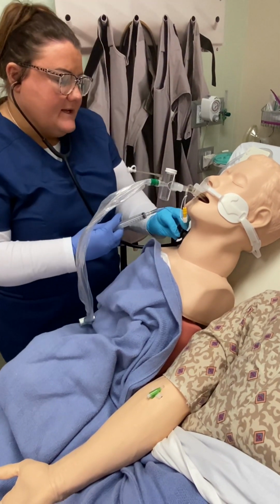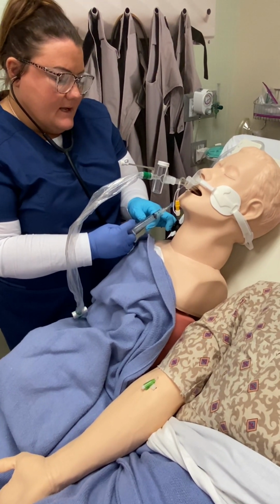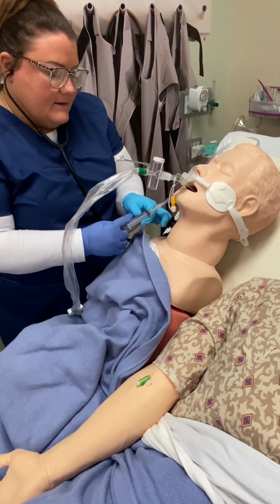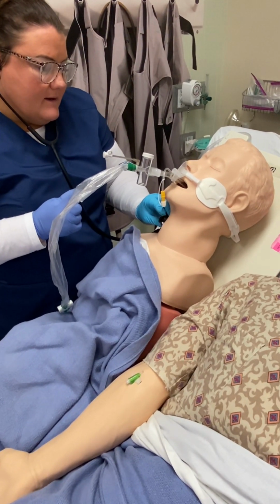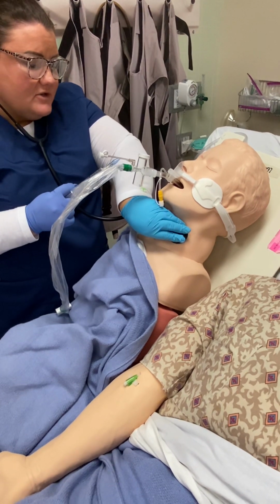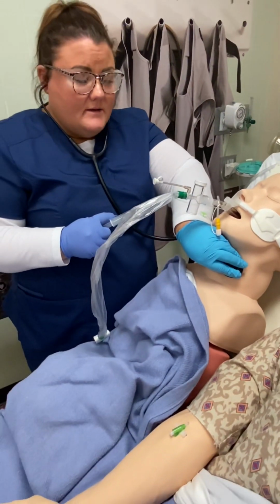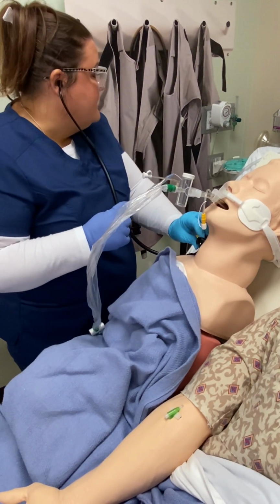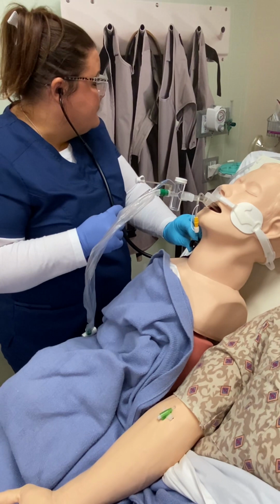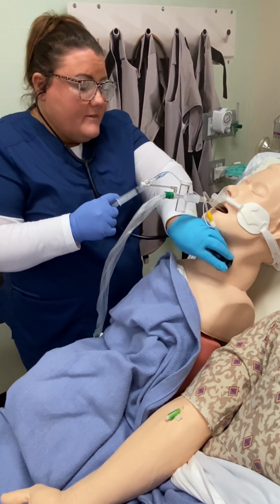Okay, Mr. Smith. Go ahead and let some of this air out until I hear air movement. Okay, and I'm just checking to make sure there's no stridor, no airway edema. I'm also notating on the ventilator that there is a leak greater than 15%, so I know that I have performed my leak test.